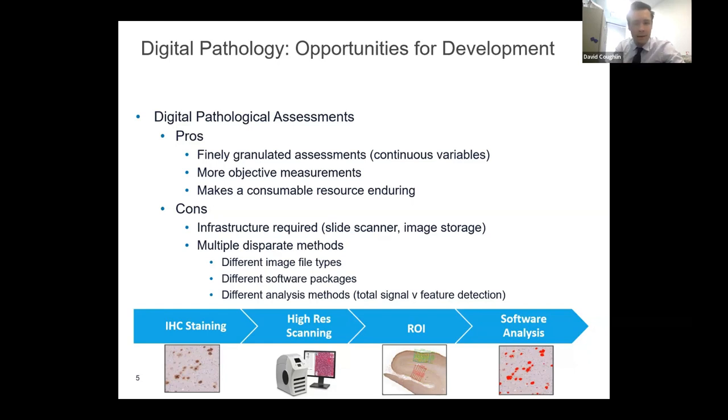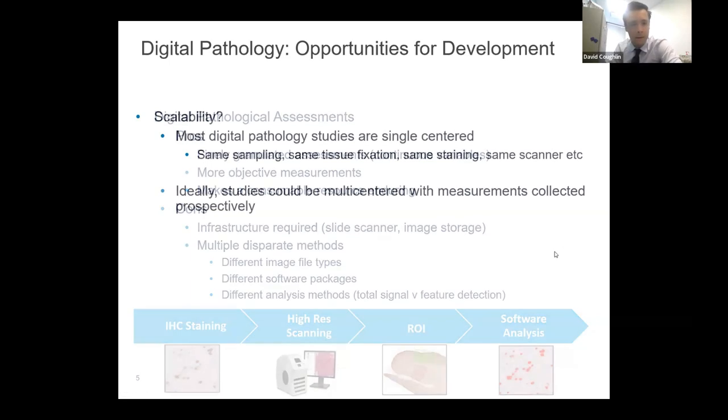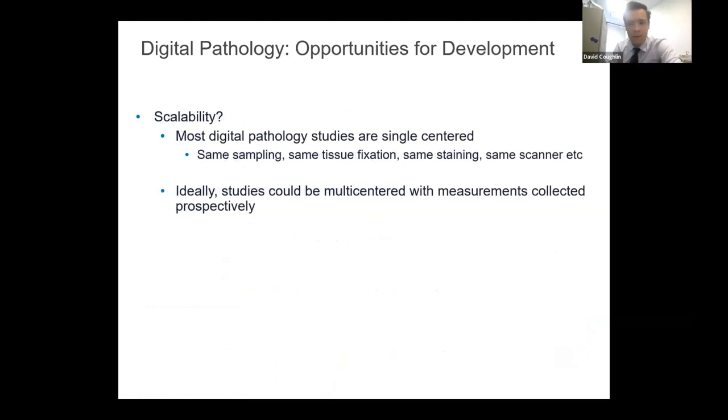And at its core, you are potentially doing different analysis methods, maybe the total signal, which is something that we're going to talk about, versus feature detection and machine learning, which Drs. Koga and Farrell are going to talk about here today. And then one other big question is scalability.